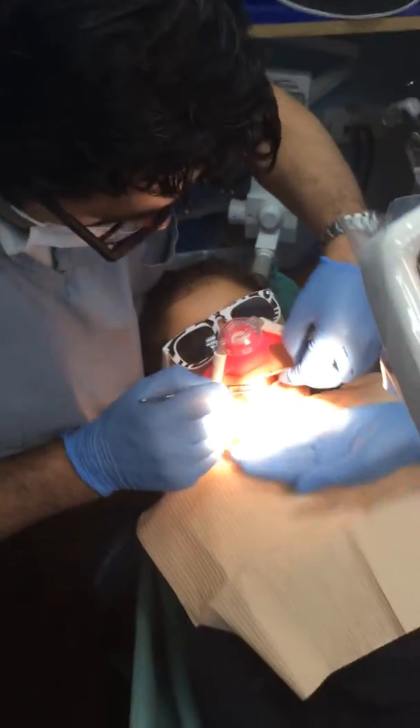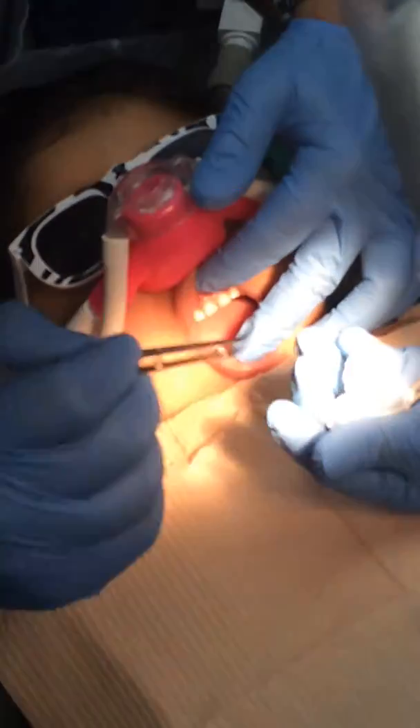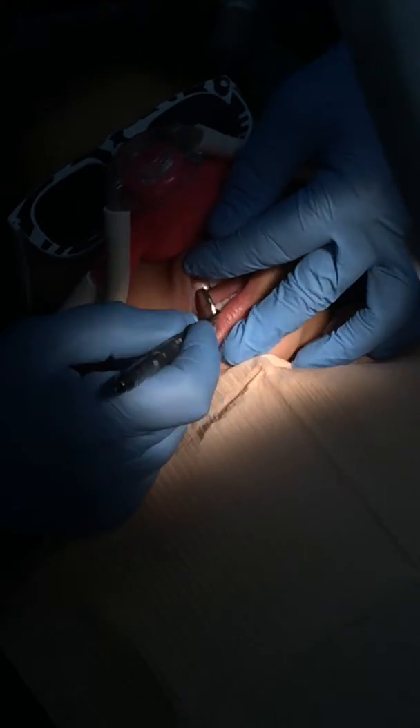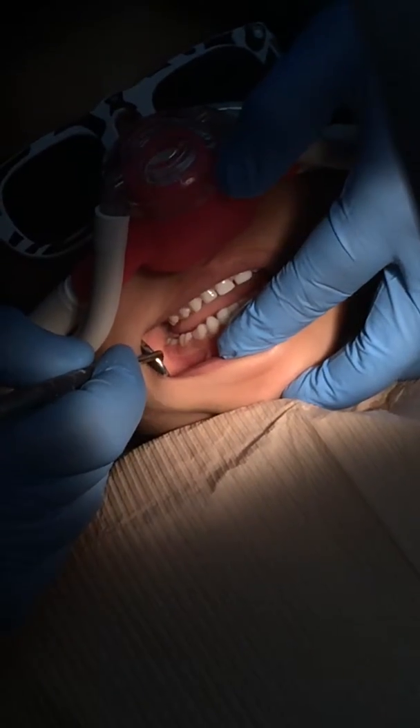We're going to take out the packing and the topical, and we can retract the vestibule and see that you can't actually see any topical cream — it's all absorbed into the tissue.